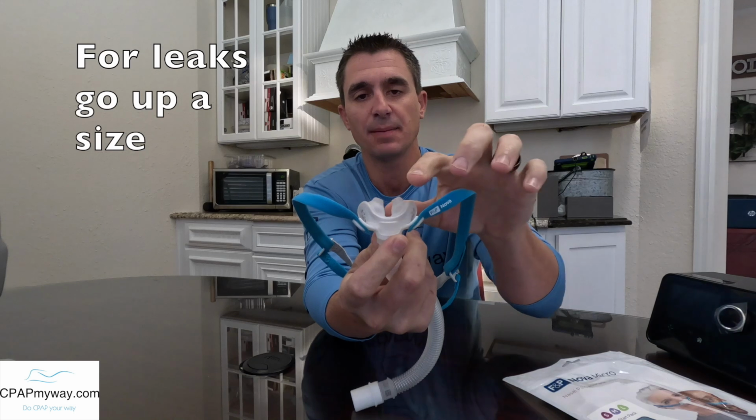It tends on these kind of masks to want to leak around the sides there, and so if you get that, or even out the front a little bit, go up a size. I have heard some contrasting opinion to that, in that it fits some people better when they went down a size. So that's the nice thing about a fit pack. As easy as this is to swap out, you could try multiple sizes just to see not only which one fits you best, but which one's more comfortable. There is no one size fits all for everybody, for sure.